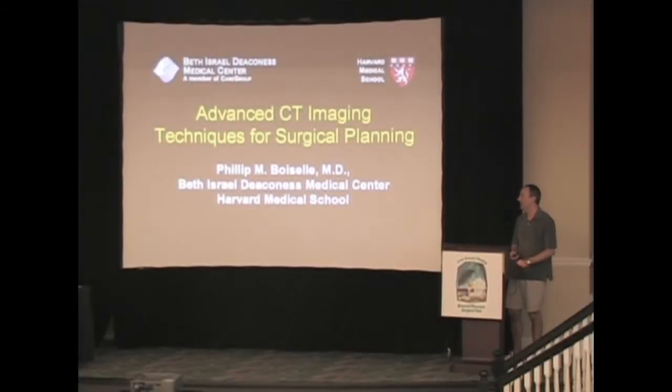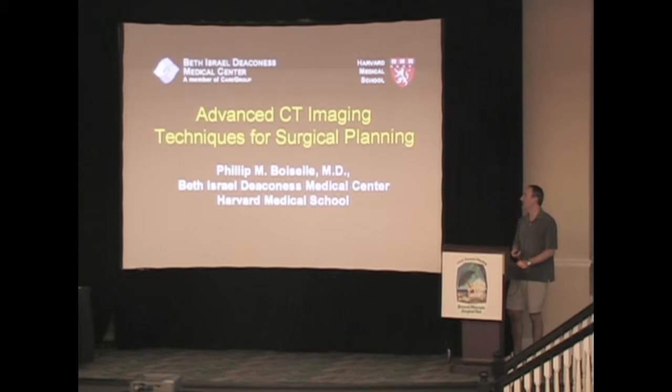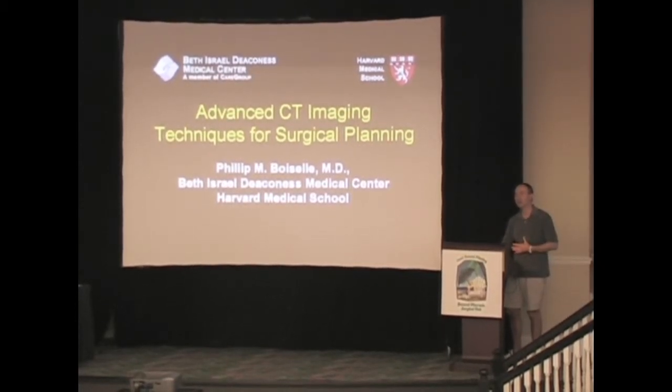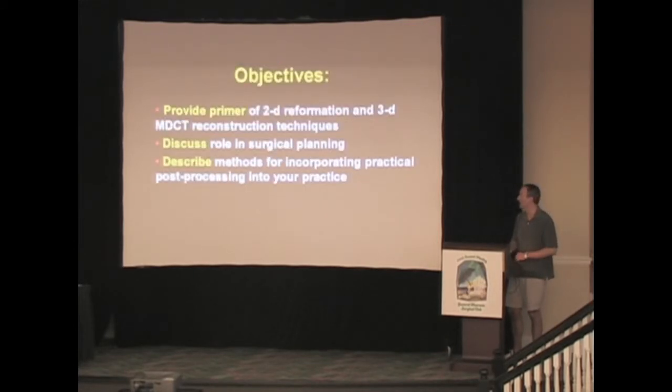Pleasure to speak with you again, and I'll be talking about advanced CT imaging techniques for surgical planning. So this will be more of a broad spectrum. I won't be focusing on the esophagus.